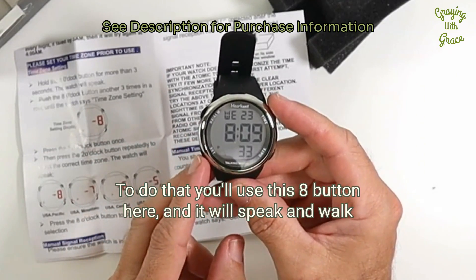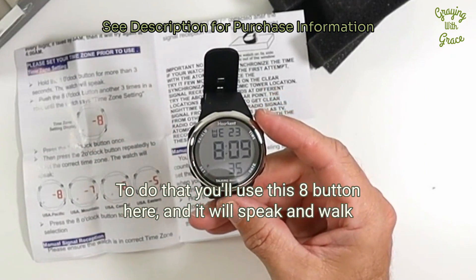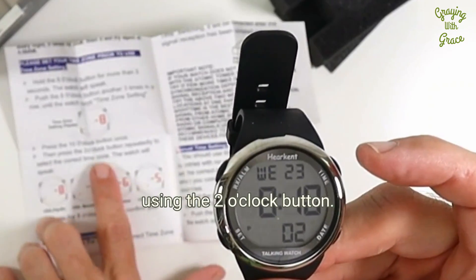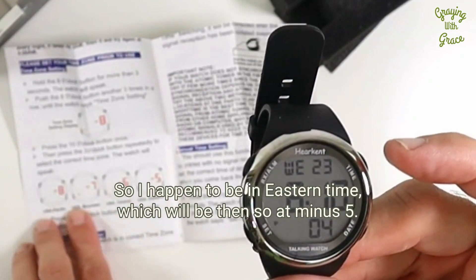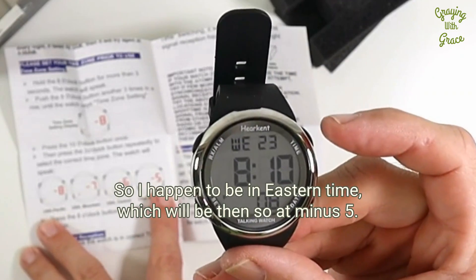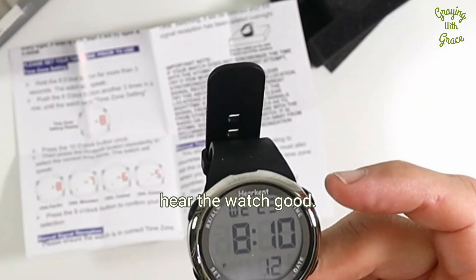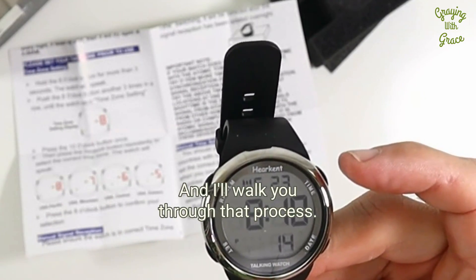To do that, you'll use this eight o'clock button here and it will speak and walk you through the functions. It's got this chart here showing where you need to set it using the two o'clock button. I happen to be in Eastern time, which is minus five. Let me move my microphone up here so you can hear the watch, and I'll walk you through that process.